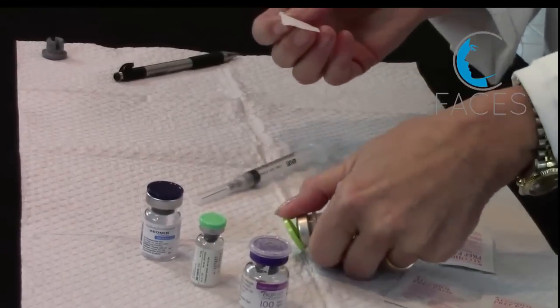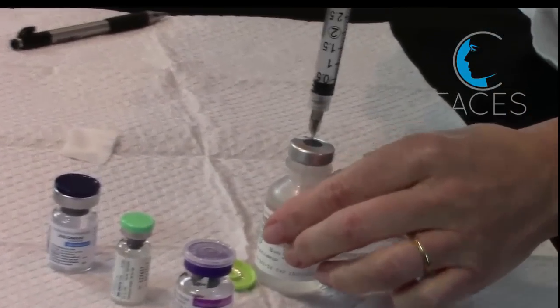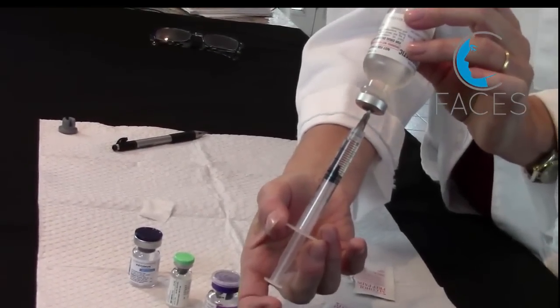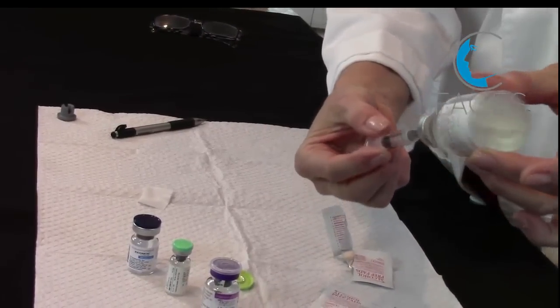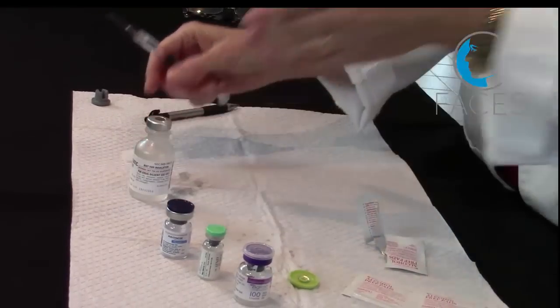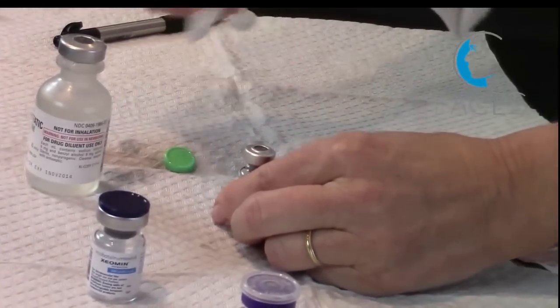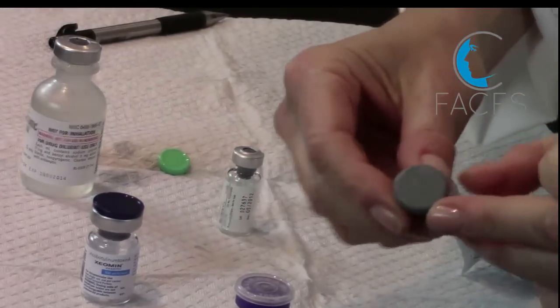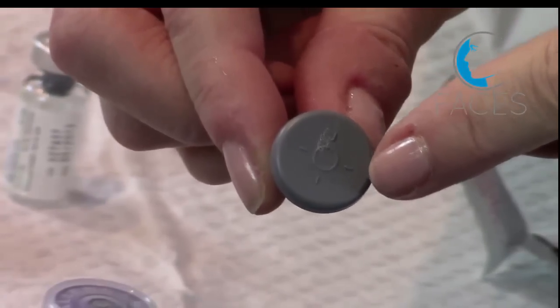We'll begin by wiping the rubber septum on our saline and inject an equal amount of air. Now I'll invert the bottle, and you'll see that because of the positive pressure, it actually pulls the volume out without myself applying any negative pressure. Now I'll wipe the septum of my neurotoxin. One thing to note here is that the top of your neurotoxin rubber stopper will have a circle on it, but you should only pierce that central circle area with your needle, because the central area is the thinnest part of the cork.